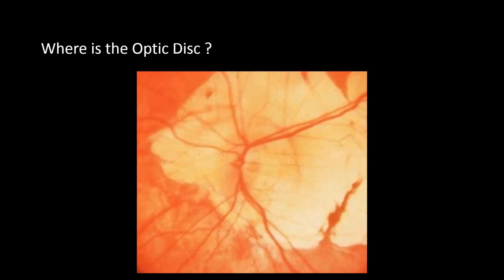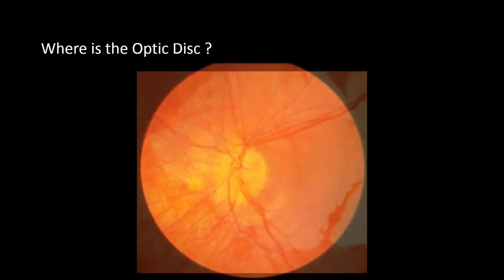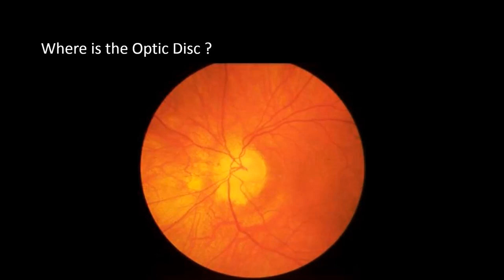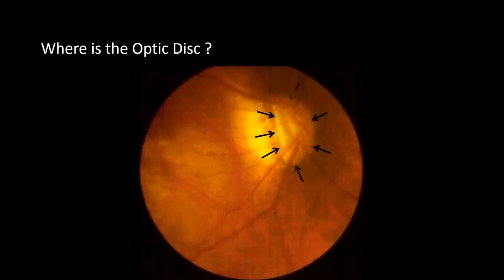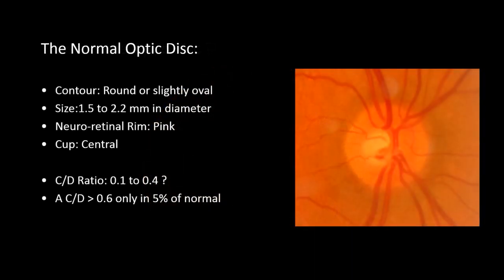Revisiting the optic disc photos shared earlier: in one photo, it's a small oval optic disc with a flat surface and no cupping in a hyperopic eye. Tracing the disc margin in another photo reveals an oval tilted optic disc, again with no cupping, in high myopia. Finally, here is a small oval vertical disc with no cupping in a posterior coloboma in a hyperopic eye.